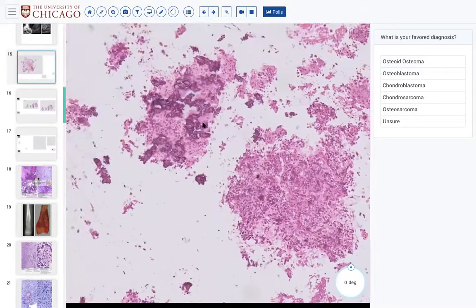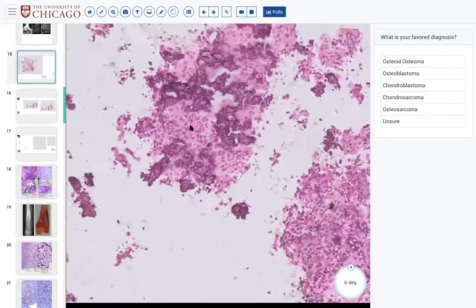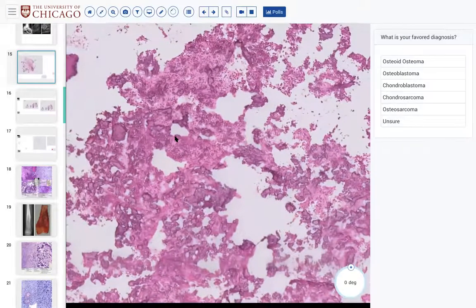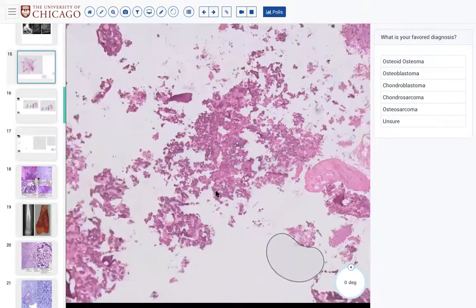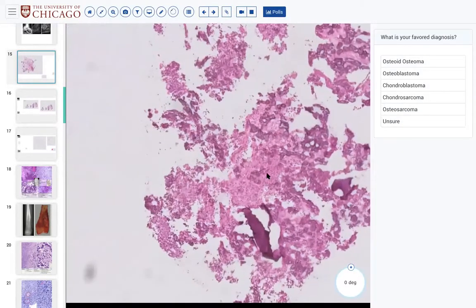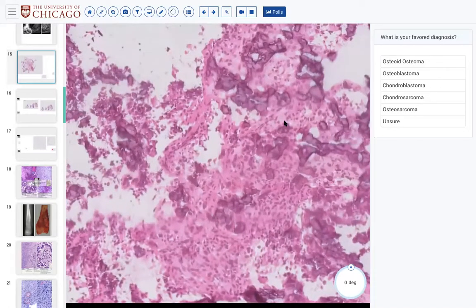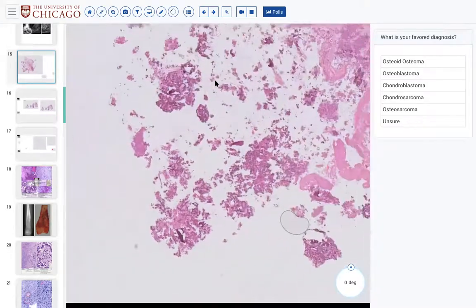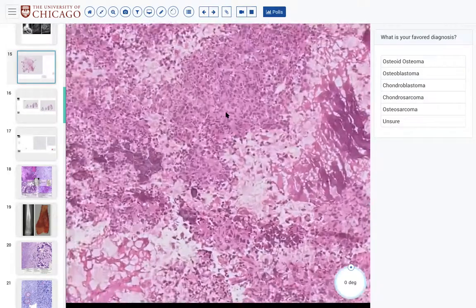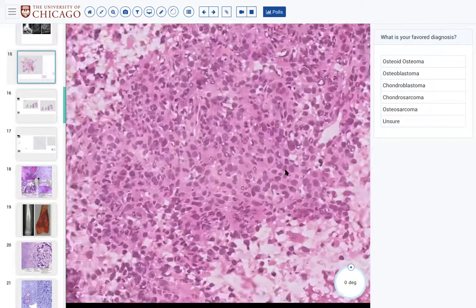I thought it was an osteoblastoma. Okay. Can you tell us why? That's a good thought. So I was going more towards this epithelioid variant, or I don't know if it's necessarily a variant, but there are these epithelioid cells that are super plump and eosinophilic. I wish we had more tissue or more bone to see this very well demarcation between malignant and non-malignant bone.